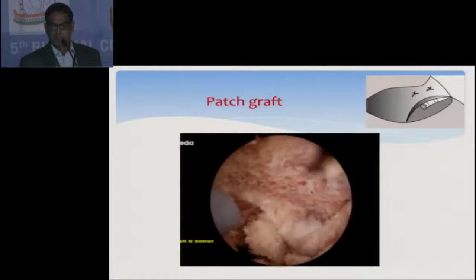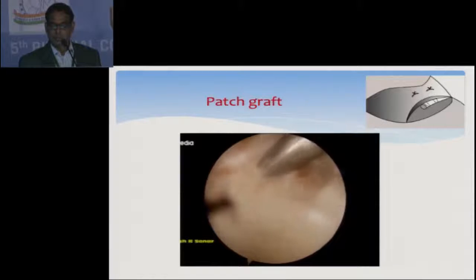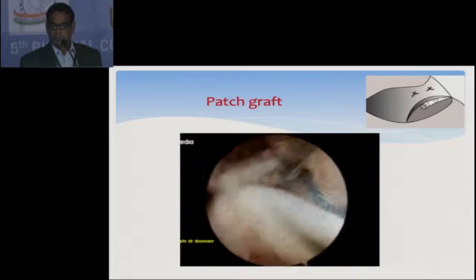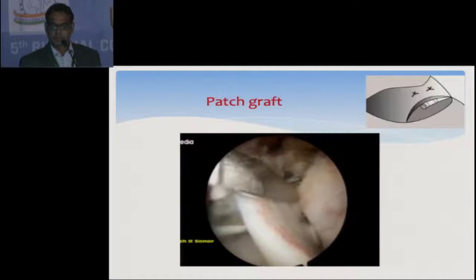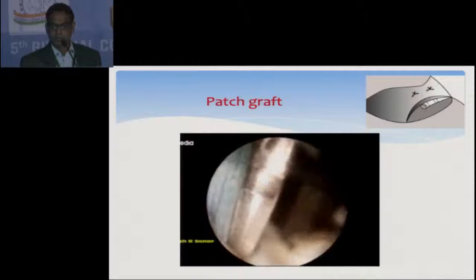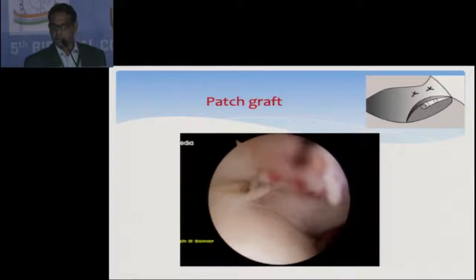Initially I repaired the subscapularis, then did the acromioplasty. Here you can see a big subacromial bursal tear. I pulled out the biceps into the subacromial space, passed the biceps through that torn hole in the supraspinatus, and then repaired it over it. You can see the intra-articular view — this acts like a patch graft.